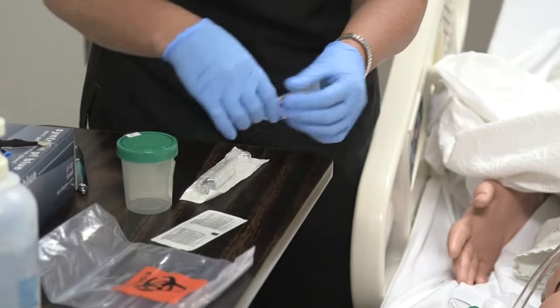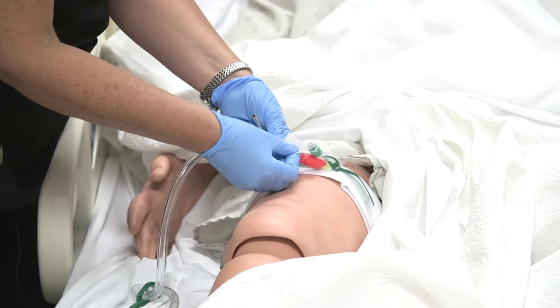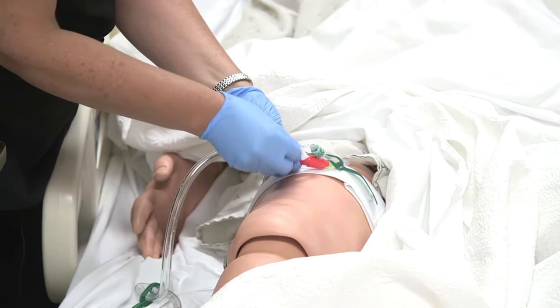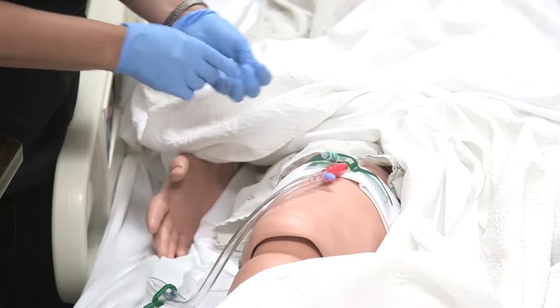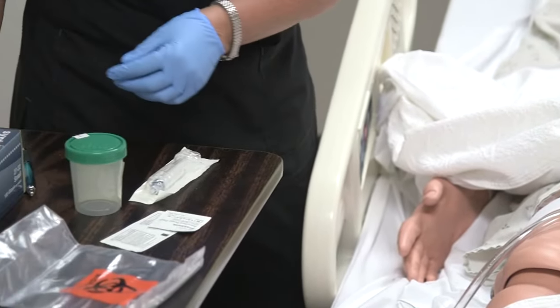The first thing you're going to want to do is clean off the port that you're going to be taking the sample from. This is a luer lock port — it's got a back valve on it, so nothing's coming out of it. This other port, remember, is for the balloon, so we do not want to be taking anything out of there.